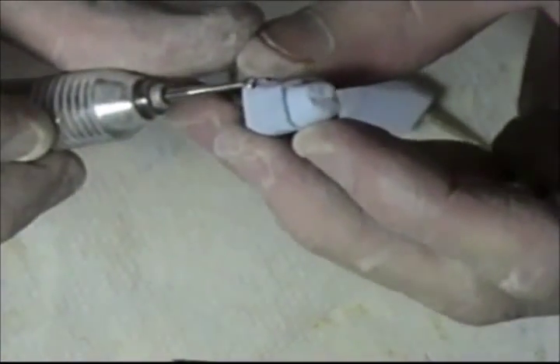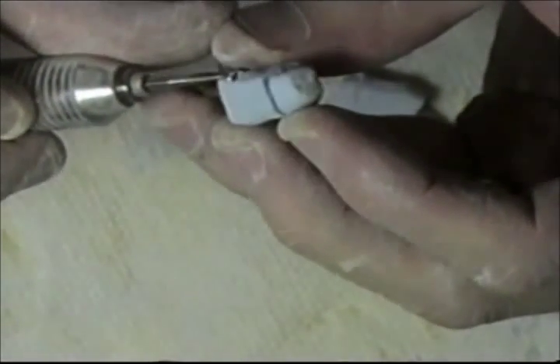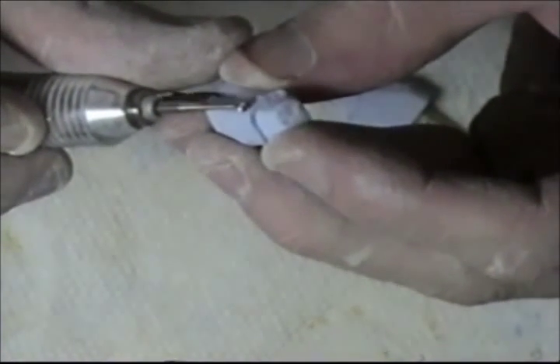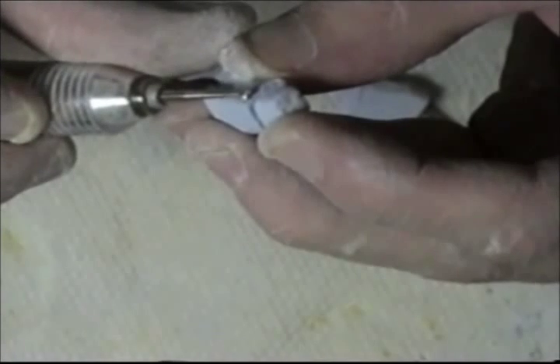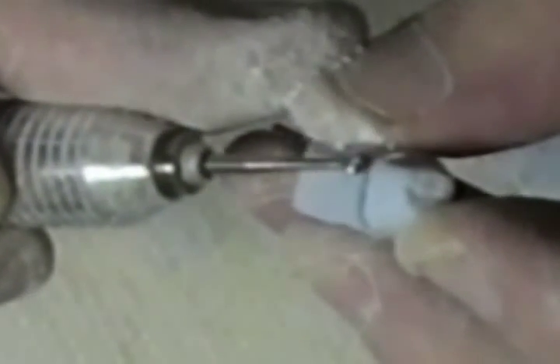Then finally I will use a number eight round burr and I will get even closer to the margin. I will form a ditch under the margin, and it will chip away any remaining excess stone.